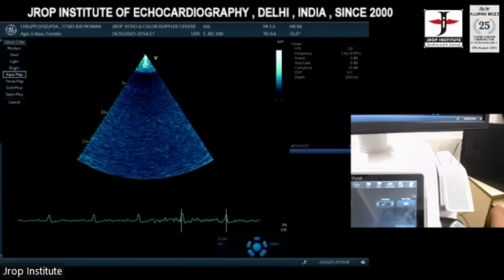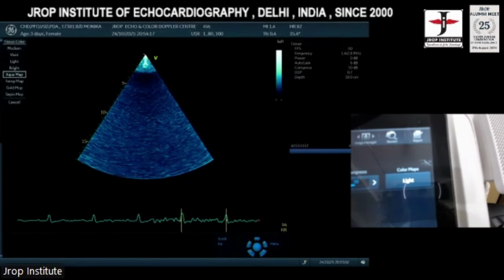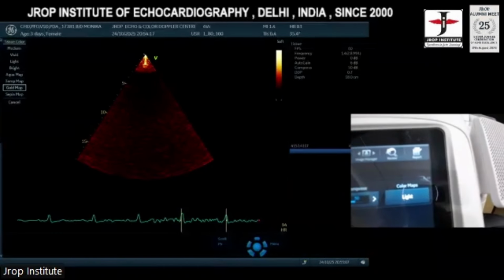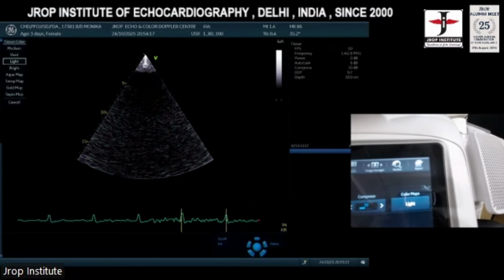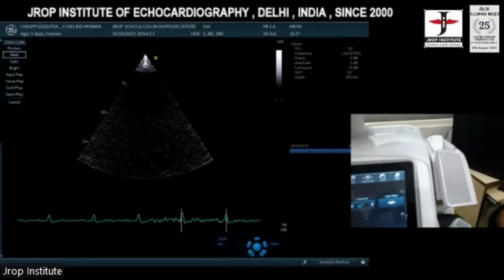Correct? Okay, sir. So look at the color map on the right side of the screen. You can change to any color you feel like. All right? Okay, sir. Thank you, sir.